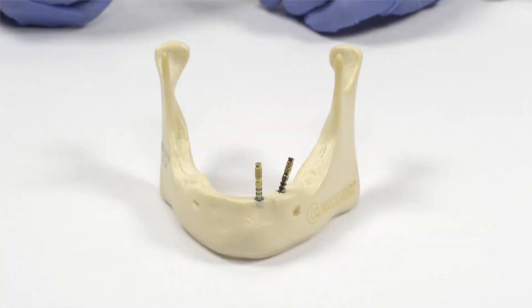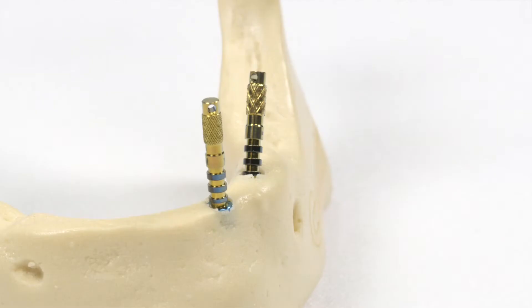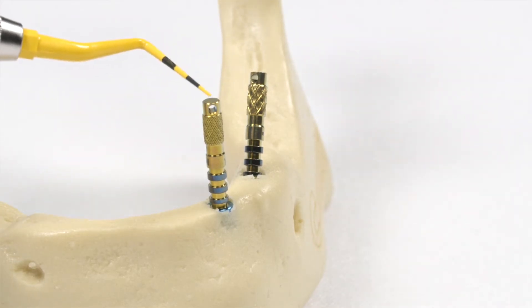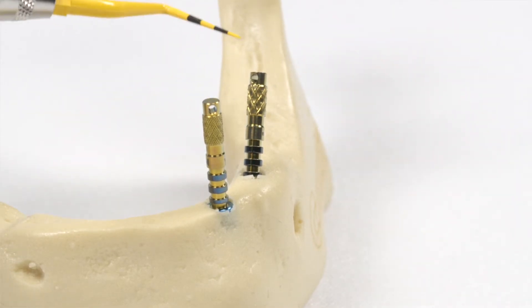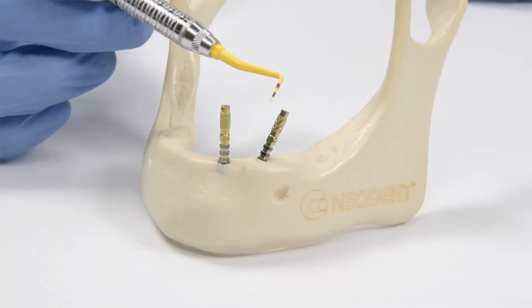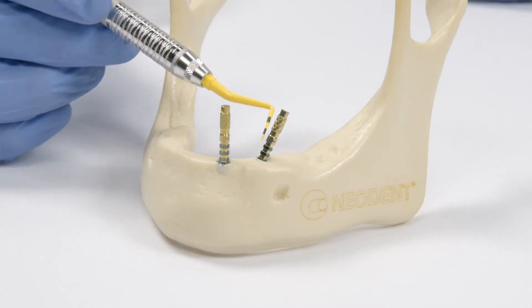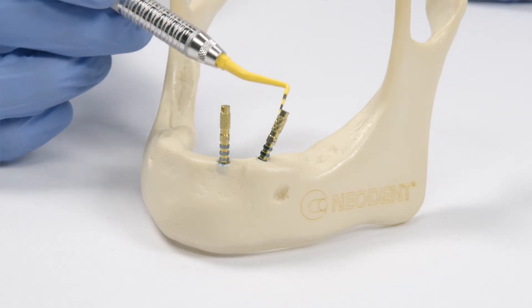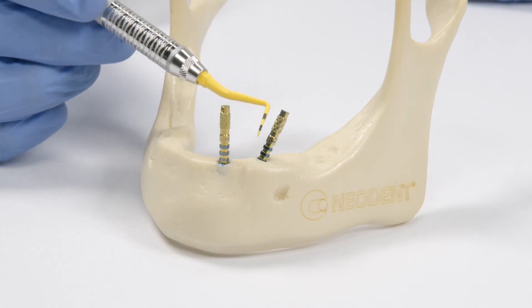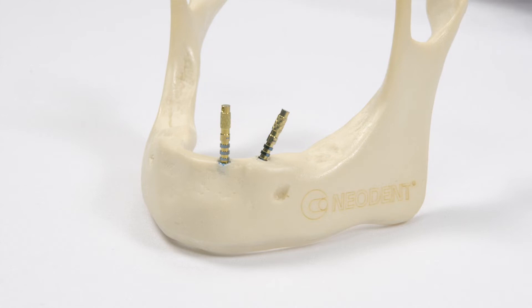This is the angled mini conical abutment in a situation where there is an implant more anterior in the mandible. The implant more anterior is straight and the implant more distal in the posterior area is tilted. The goal is to have the two implants and mini conical abutments parallel to each other, so it is best to use an angled abutment.